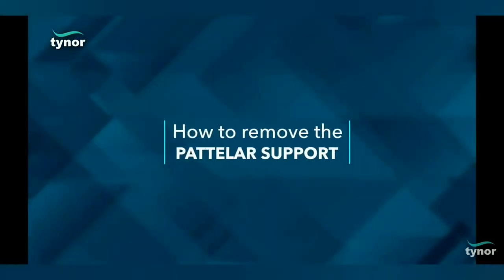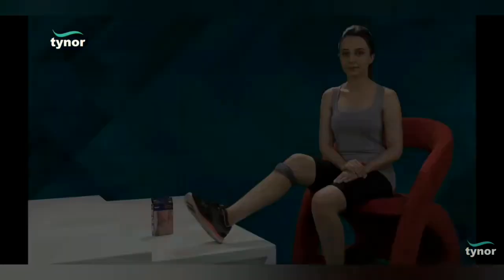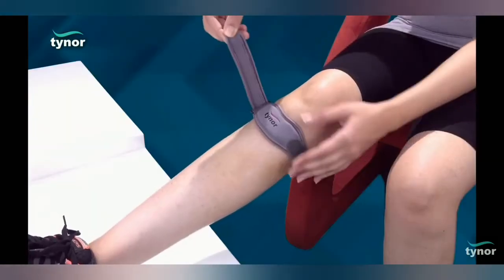Now, let us see how to remove the patellar support. The product can be simply removed by unfastening the strap.